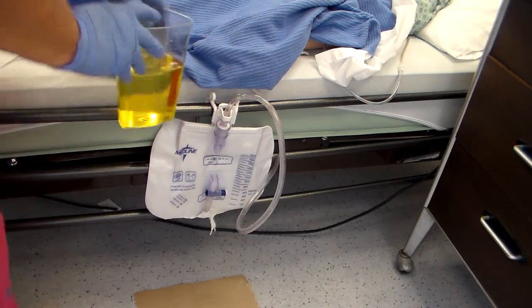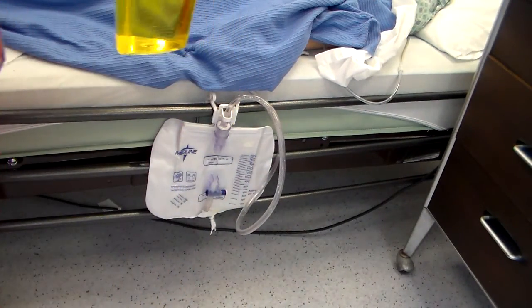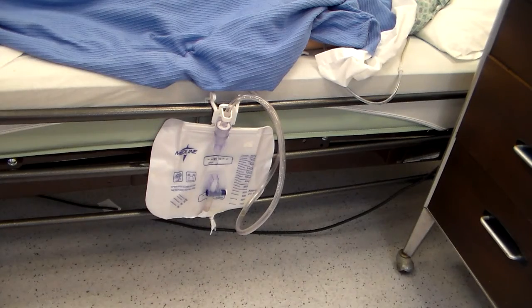Then you will clean up your supplies, so your paper towels and alcohol pad. You will dump the urine in the toilet. You will rinse the graduated cylinder. You do not just empty the urine and put the graduated cylinder back without rinsing it. You would clean up all your supplies, get rid of your gloves, wash your hands, and document all your findings. And that is emptying a collection bag.